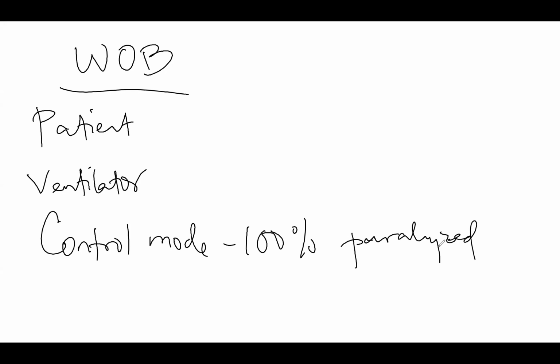The patient must be paralyzed. So the only time the control mode is used is in surgery, particularly somebody who is under general anesthesia. Because as you learned in 3rd semester when you talked about chapter 15, intra-op, a patient undergoing general anesthesia receives 3 basic medications.